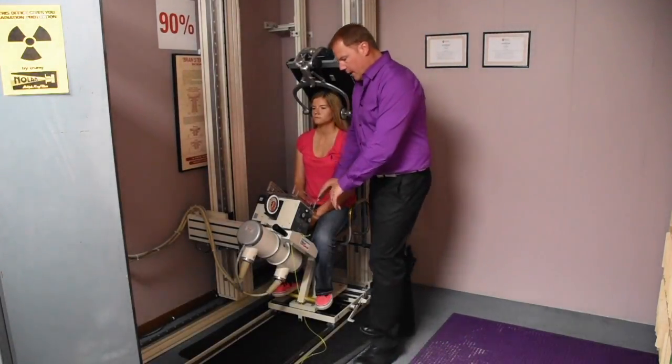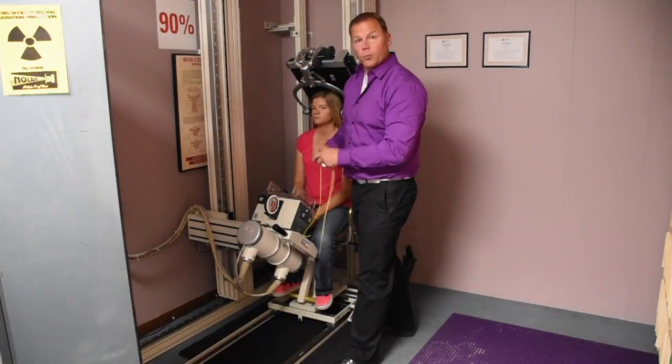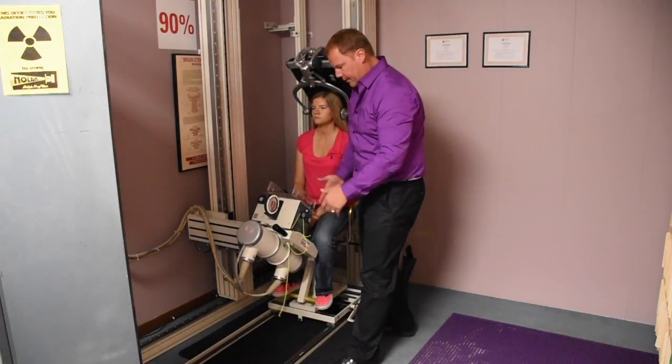The very first thing you're going to want to do is make sure our string is not in our way so we're not tripping over it. Just wrap it a little bit, just like that, so it's out of the way.